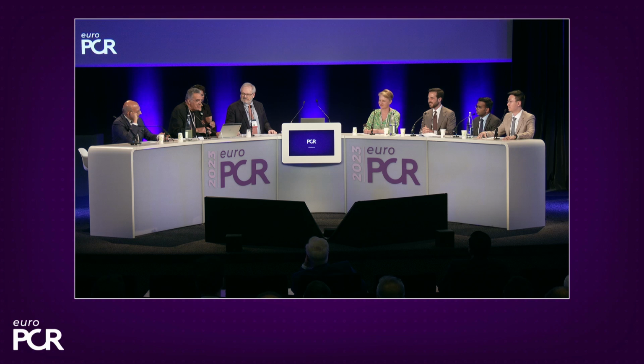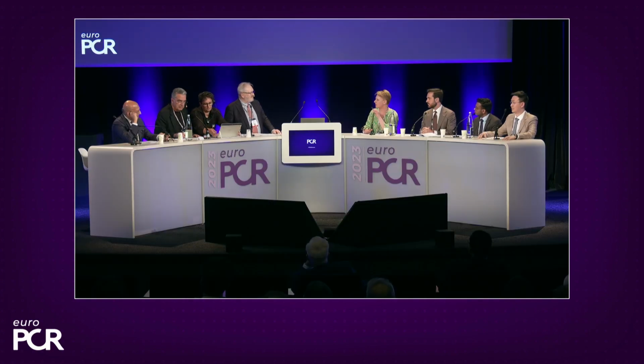The last one, very short before giving the floor to Joanna: do we have any study for comparison of CT and IVUS in assessment of severity of lesion? Yeah, I think there's a couple of studies ongoing. Carlos Collet is busy with guidance with CT versus IVUS to compare the two techniques.